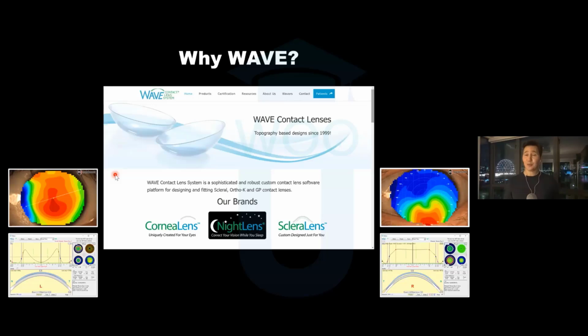So it is pretty cool stuff. And what moved me was that if I don't have a lot of familiarity with wave, there's a way to build a lens quite simply and just start with a default product in the system that gets me started. And then I can rely on the experts from that point forward if I'm feeling that there's some manipulation to landing needed or edge lift, or if there's some change that we need to make.